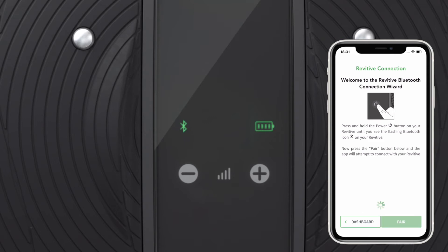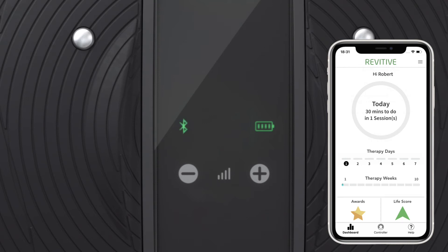After several seconds, the app will find your device and a Bluetooth pairing request will appear. Accept the pairing request in the app to complete the pairing process. You will know your phone is successfully paired when the Bluetooth icon on your device displays continuously and you are able to access the app controller screen.